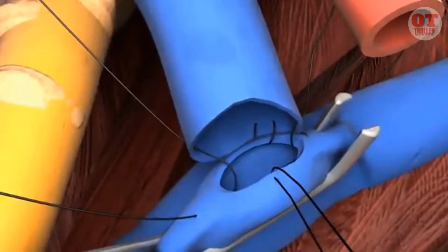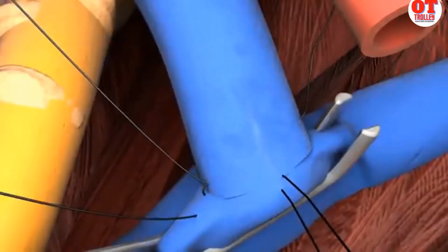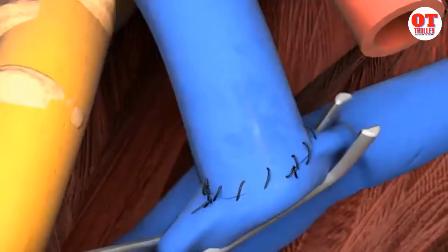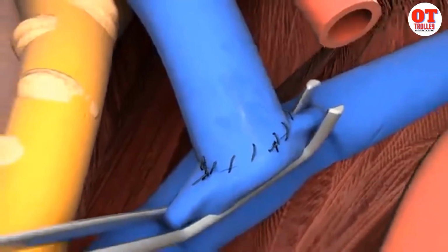The renal vein corner stitches are connected to the corners of the opening of the iliac vein, and from one corner the venous anastomosis is performed, in general by using a 5/0 unabsorbable monofilament running suture. The supporting stitch is removed and both remaining sutures are knotted.